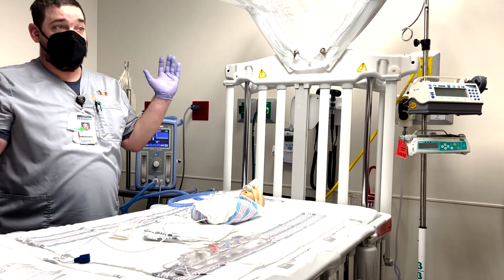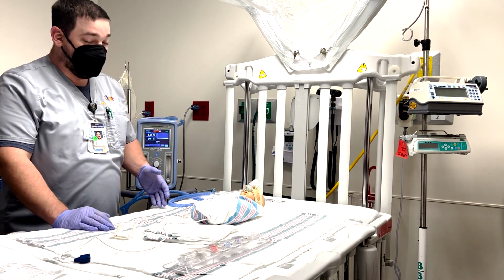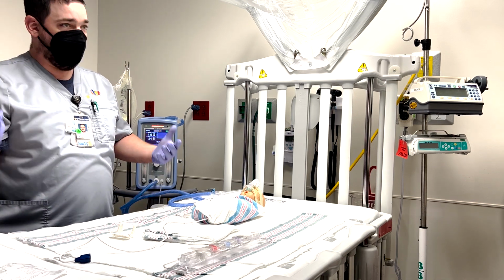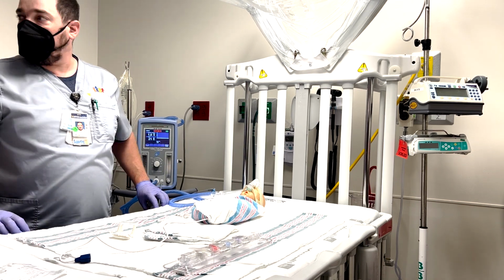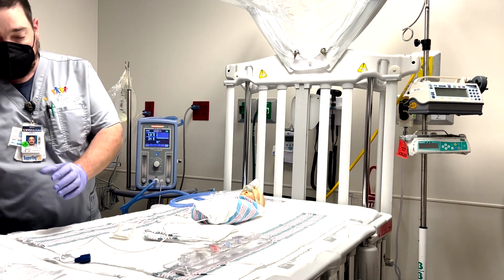They can stay and step down and be fine. But if I've got them on 6 and, oh no, they look like garbage, we're up to 50% and they're retracting, and let's go up to 7 and see how things change, that's just not going to be the case. We need to consider putting them in PICU. You're leaning towards that intubation line.